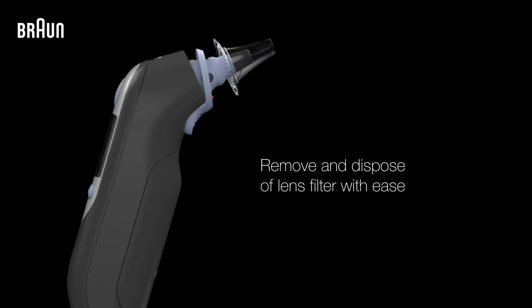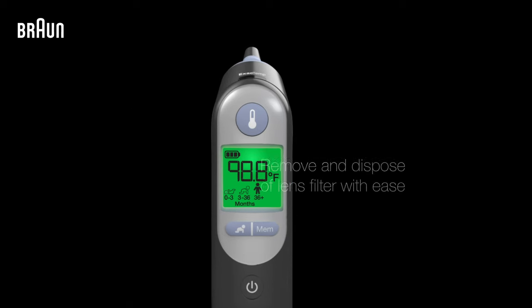Now you can remove and dispose of the lens filter by simply pressing the Eject button.